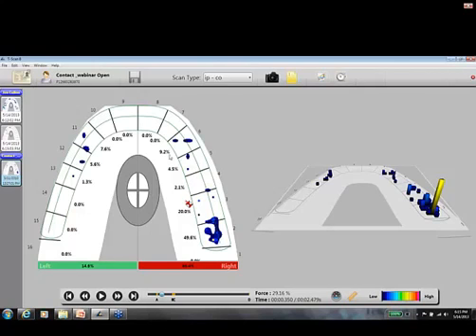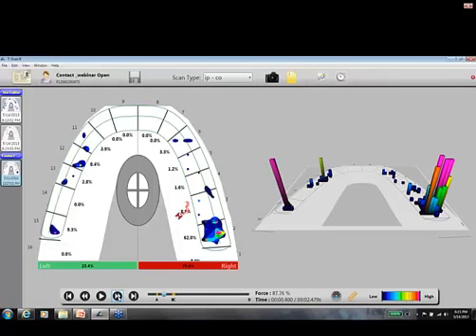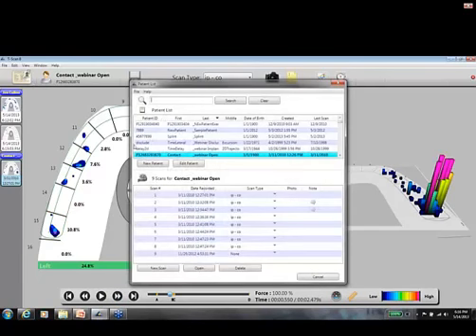We have 85% of the force on the right early on. This is the information that would be really valuable to know before you send your patient off the door, because he winds up contacting on all of his teeth, and the paper marks looked really good. But this is the information that's missing. So let's see, I'm going to go through and show you what we did.